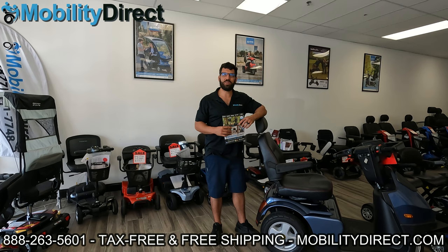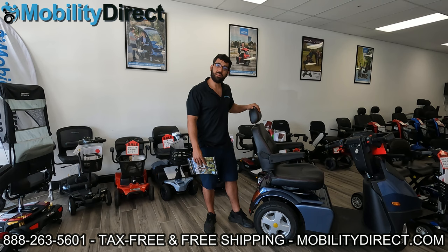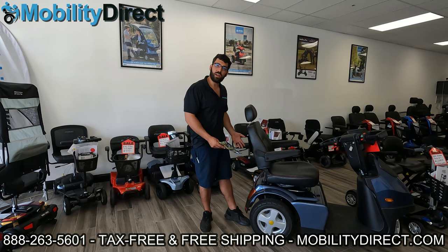Hi everybody. I'm Sergio with Mobility Direct, and welcome to today's YouTube video. In today's video, we're going to talk about mobility scooter seats — how to remove them, how to rotate them, and what to do if they're stuck, which is a really common question that we get.